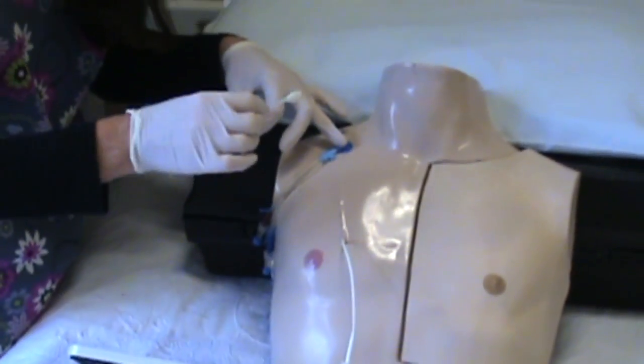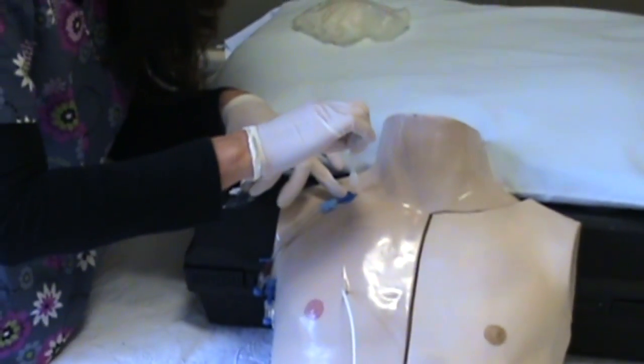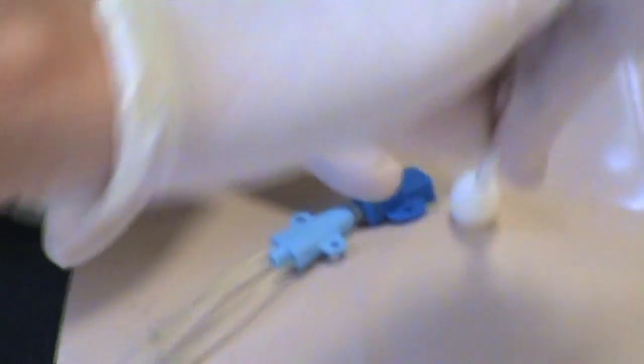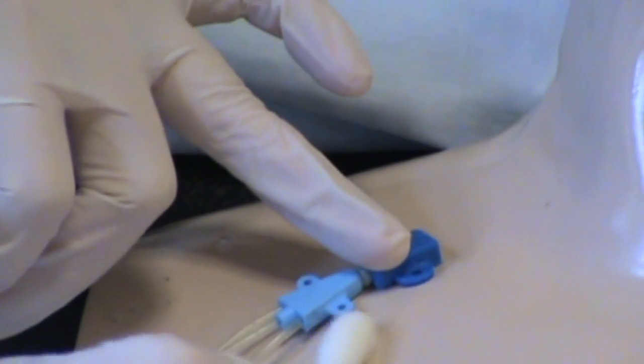Then you'll take it, and I'm going to establish a dirty finger here to stabilize it. Right where it goes in is where you want to start, and you want to swab it from inner to outer, pulling the germs away from the port of entry. As you swab it, you can rotate the swab stick and twirl it around a little bit.